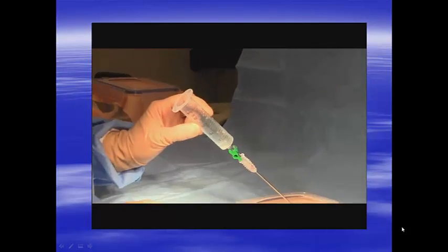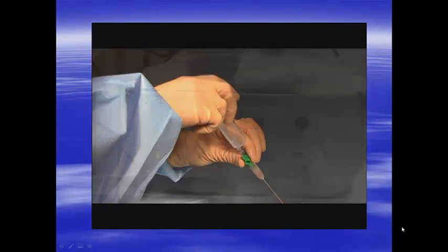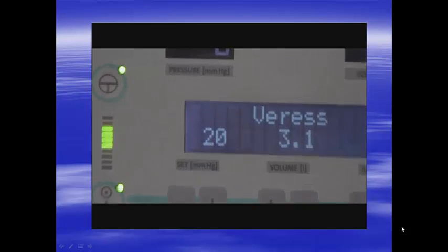A further observation of low intra-abdominal pressure confirms peritoneal placement. Pressure should be less than 10 mmHg.